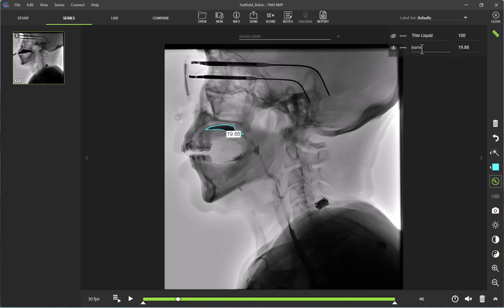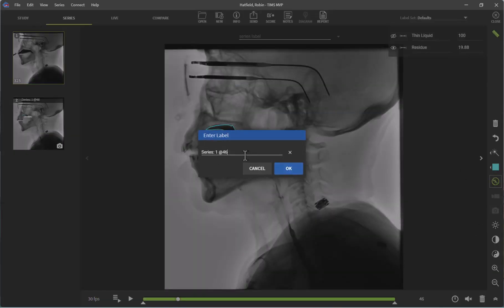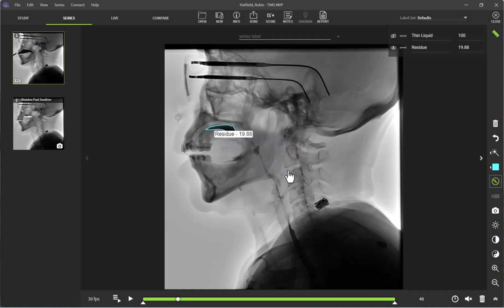So I can go ahead and label this as residue. And if I wanted to, I could actually take a snapshot of this with my camera icon here and label it, then include it in my customized reporting available in the TIMSS MVP software.